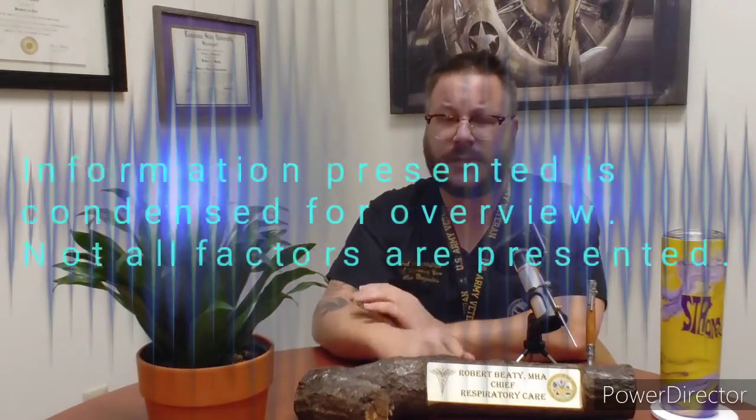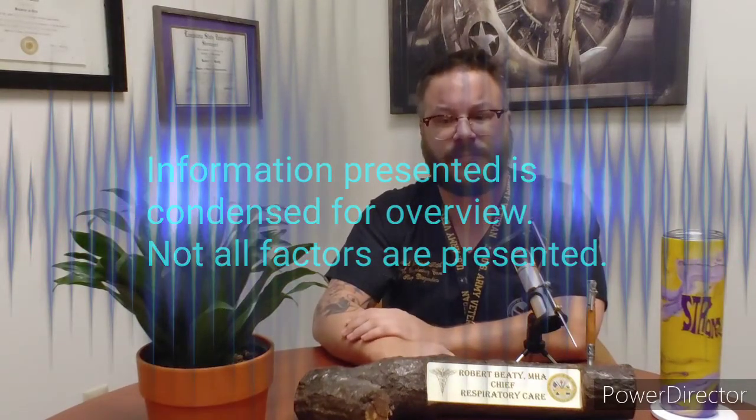Today we're continuing our discussion on APRV, and as promised, we're going to talk about settings today. Now, it's not as confusing as it seems. There are really only 5 major settings in APRV, and 2 of those are set it and forget it. Those 2 are time low and pressure low. Most of the time we set these and they don't change until we start to wean the patient.